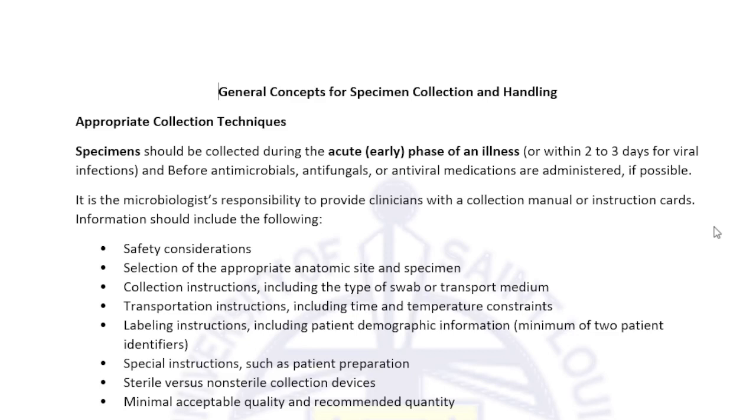Okay, so we have the responsibility to ensure that the specimens are of good quality so that we can grow the bacteria that are present in it. An example of this situation is what if the collection happens in a physician's lab, tapos ipapadala lang sa atin dun sa main laboratory yung sample. So, we must provide instruction on the specimen transport, kasi there are specimens that must be transported with ice. Yung iba naman should be transported at room temperature.